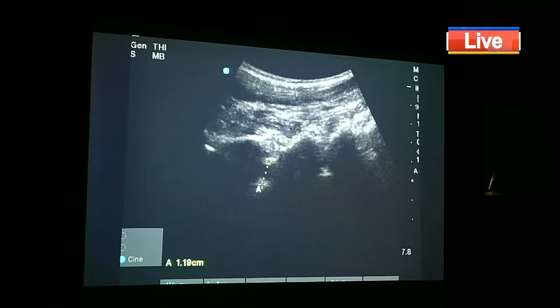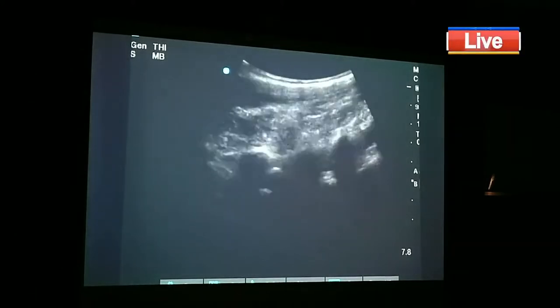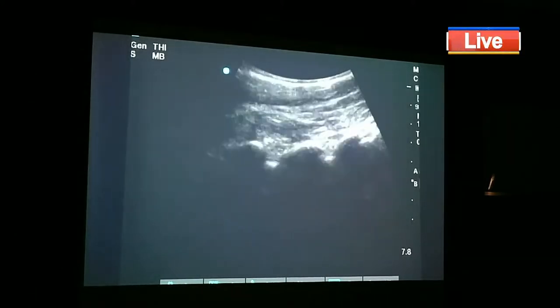So look, this is how you play with this. This is real VR and AR. Okay, so now those of you who are saying I only want to do anesthesia, you use this in your anesthesia practice. Those of you who want to venture into pain, you can use this in your pain practice also. Okay, so you use the tool. So I've shown the paramedian view. Now the last view, which is the facet view.